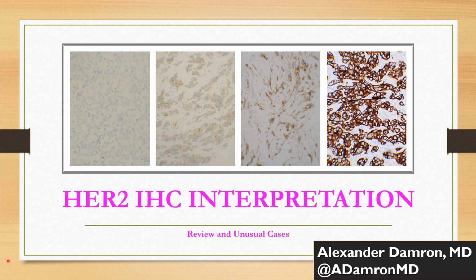In this video we're going to be covering HER2 immunohistochemical analysis of breast cancer, and specifically I want to go through the steps that I take when I approach these cases, because if you study breast cancer and you're into breast pathology, you know that HER2 interpretation is not necessarily as easy as it seems, right? Things kind of straddle the lines between 0 and 1 and 2 and 3 plus, and often we're put in that scenario, do I call this 3 plus or do I call it 2 and get CISH? And sometimes you're like, well, I'll go CISH, and if that's amplified, I guess it's positive, right?